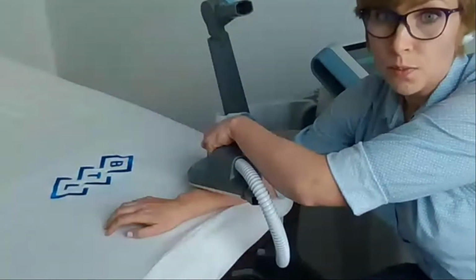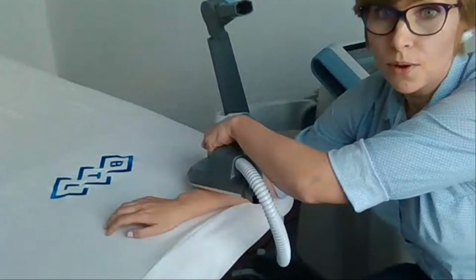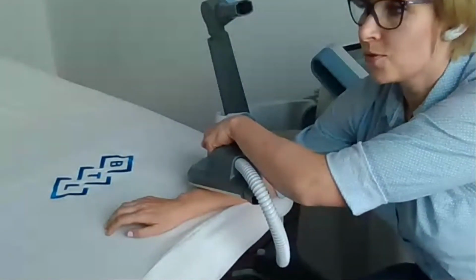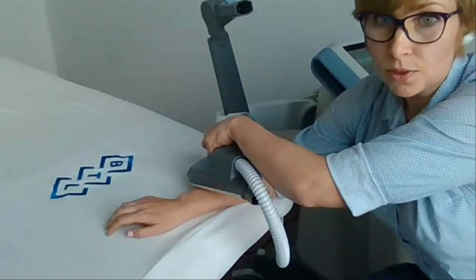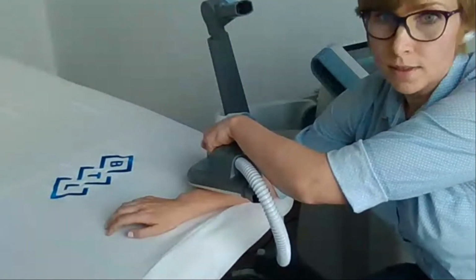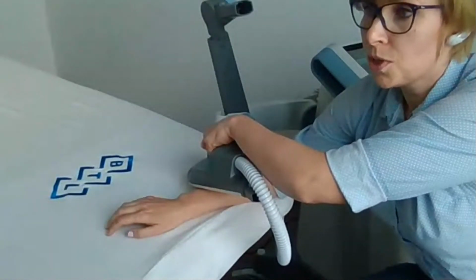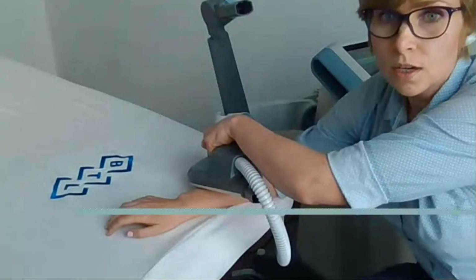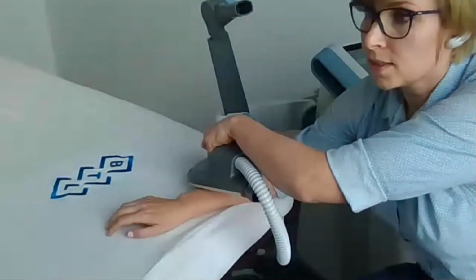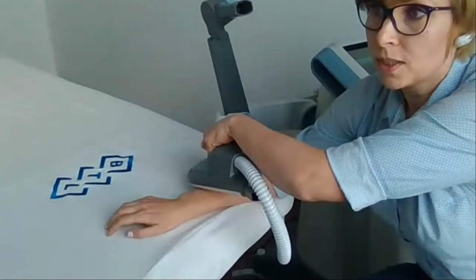And after the treatment, the tissue might be a little bit tired. So we know that even if the treatment is very comfortable, very pleasant, and the patients adore this kind of modality, we need to be sure that everything works fine, and after the treatment, even if this is very pleasant, the tissue will feel that the treatment happened.